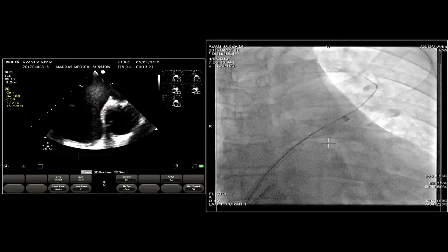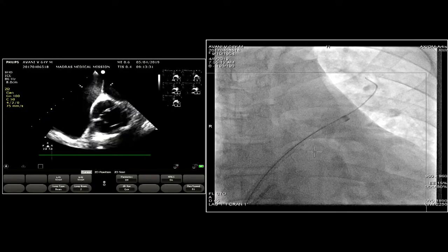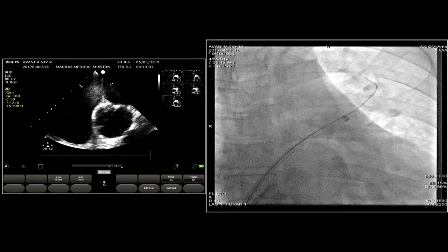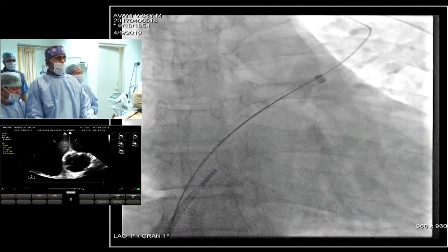Yeah. So the second question is about the restrictive left ventricular physiology. I want a small bowl of water. So in order to ensure that he doesn't get into a restrictive left ventricular physiology, we do an LV end-diastolic pressure assessment, and our LV end-diastolic pressure here was marginally higher, around 16. The 16 is not prohibitively high, and so we are just going to watch with a complete occlusion how things are.